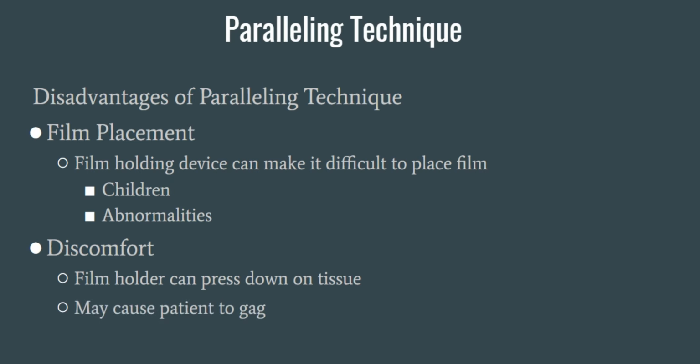And the other part of that is the gag reflex. It can cause that patient to gag if it's the first time they've ever had the XCP in their mouth, or if they just have a sensitive gag reflex. And that concludes the paralleling technique. So let's review.